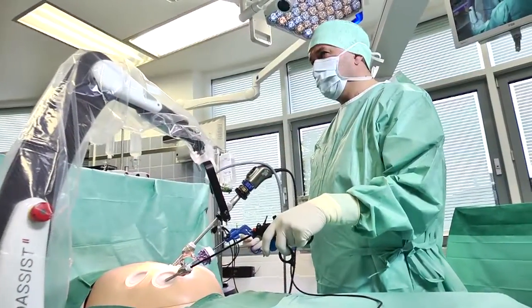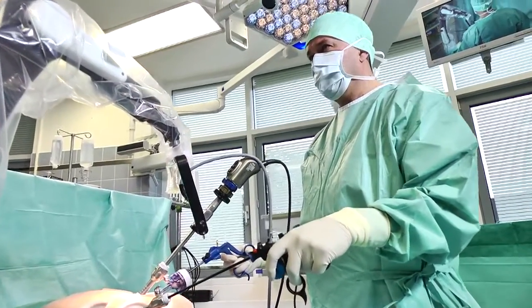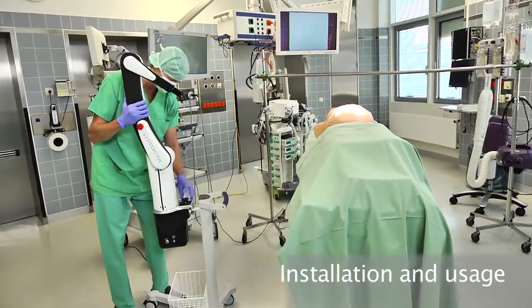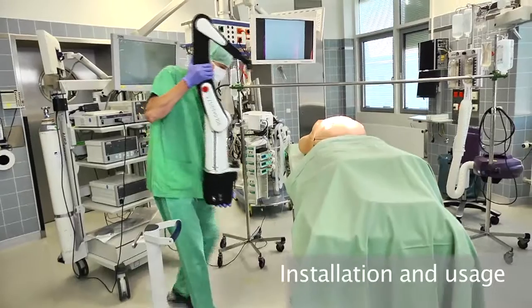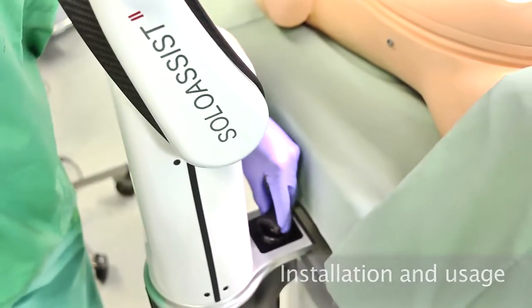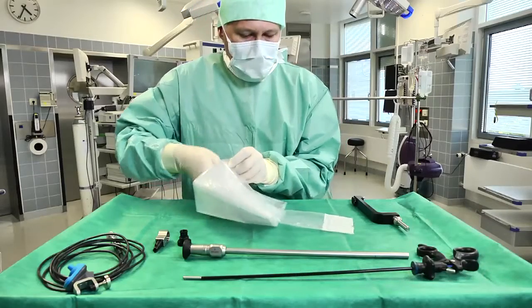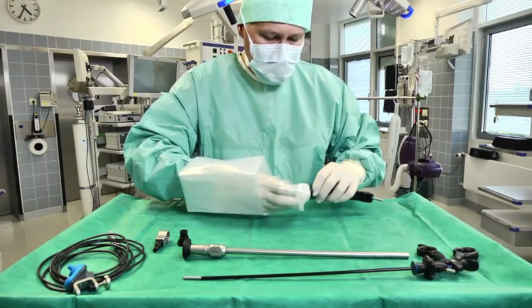The Solo Assist can be installed over the entire length of the operating table, granting the surgeon maximum freedom of movement. As soon as a patient is under anesthetic, the operating staff can start their preparations. The complete Solo Assist weighs just 10 kilograms and can be attached to the operating table very quickly.